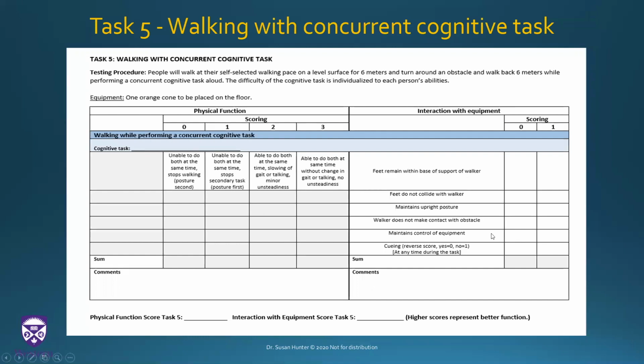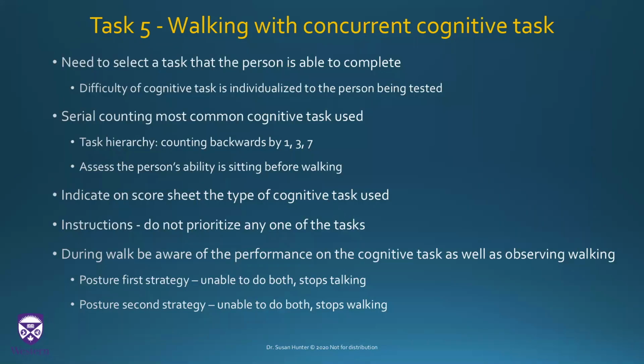The interaction with equipment stays the same. Do the feet remain within the base of support? The feet do not collide with the walker. They maintain upright posture, the walker does not make contact with any obstacles in the environment, and they maintain control. This one is a little bit more complicated in terms of finding the cognitive task that you want to assess for the person.